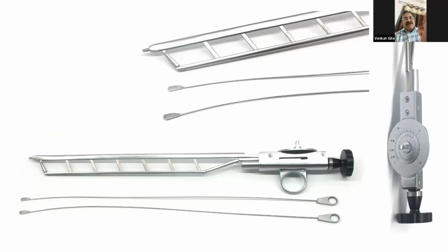So the chances of bleeding here, if you stretch right up to 45 French, then it will bleed. If it is required to stretch up to 26, and if you open up to 45, then it will definitely tear and bleed. But if you open up to the required French, and if you just pull that blade inside, it will cut only 3 millimeters. So chances of bleeding are less. One thing: if you put it inside the bladder also, nothing will happen.